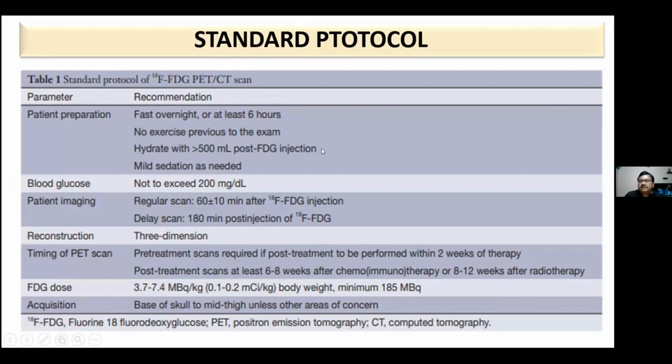Once we give the injection, we need to hydrate the patient. For this, we are already giving the oral contrast, so the hydration is done with that. Mild sedation may be required in children who are of lesser age, maybe 3 or 4 or 6 or 8 years of age. Those patients may require sedation because they may not be able to lie still on the scan.